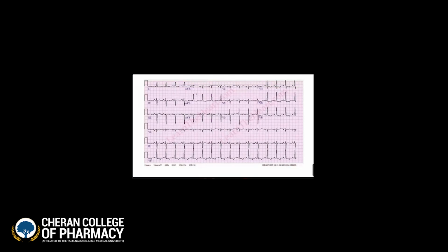Previously there were such scenarios, and even now some hospitals see them. If aVR is positive, exchange the leads.